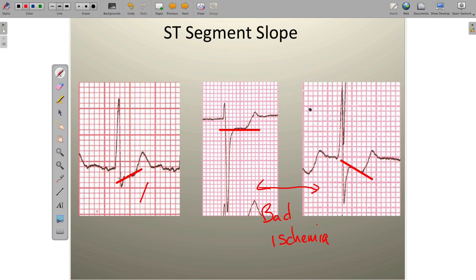In the example shown here, however, the slope of the ST segment is really lazy. So these three slopes illustrated on this chart are all bad and all indicate ischemia. A lazily rising up-sloping ST segment is bad. A horizontal ST segment is always bad. And a down-sloping ST segment is always bad. All are signs of myocardial ischemia and really important to identify on the EKG.